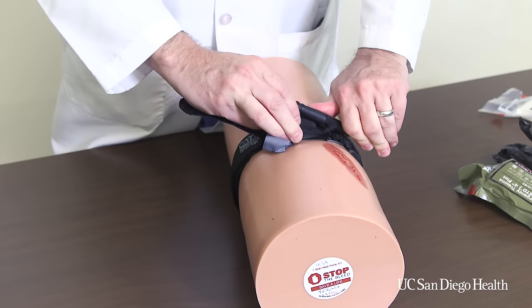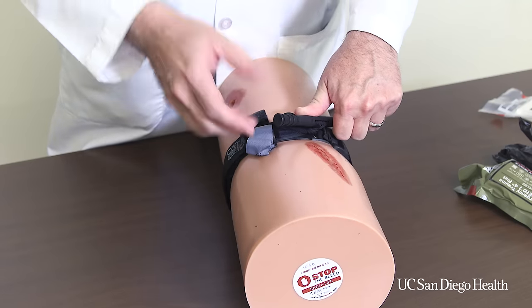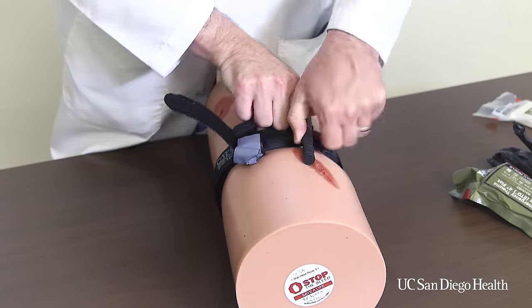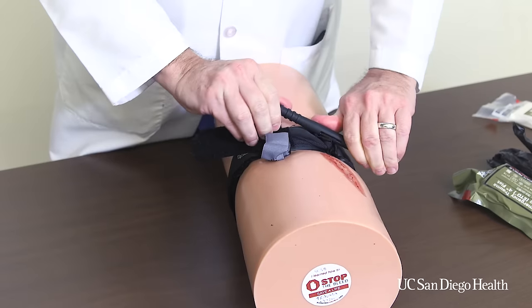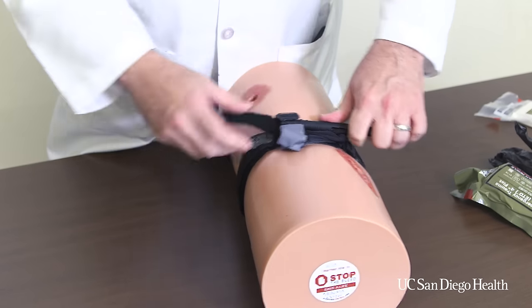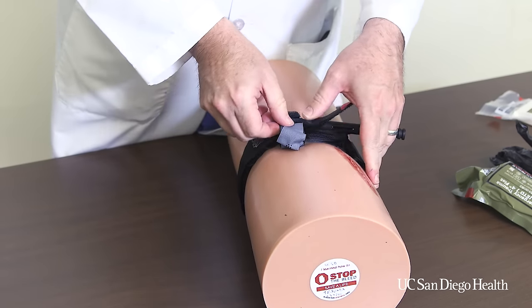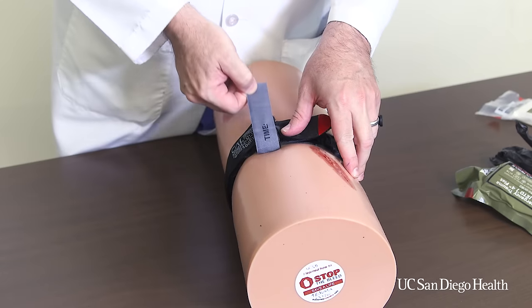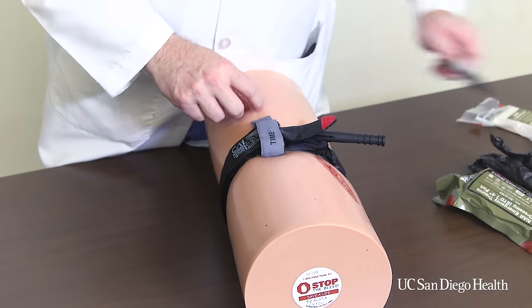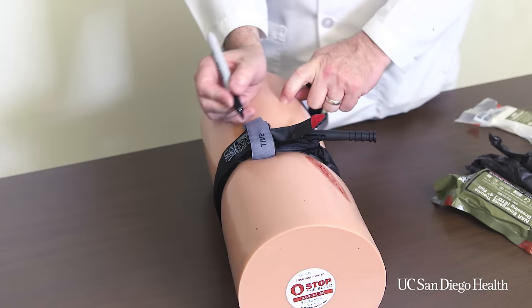The tourniquet will tighten. Keep twisting until the bleeding stops. The patient will find this uncomfortable and you'll have to reassure them that this is important to stop them from bleeding to death. Once you have the tourniquet tight enough, allow the clip to hold the rod. Put the remaining strap through the clip and take the windlass strap across. Then take your marking pen and write down the time of application.